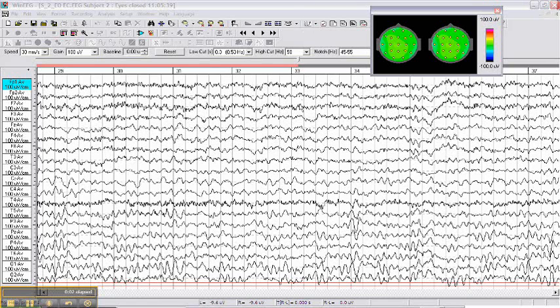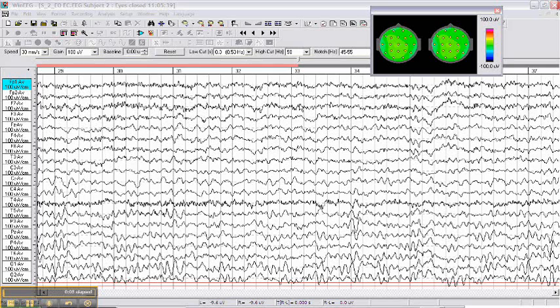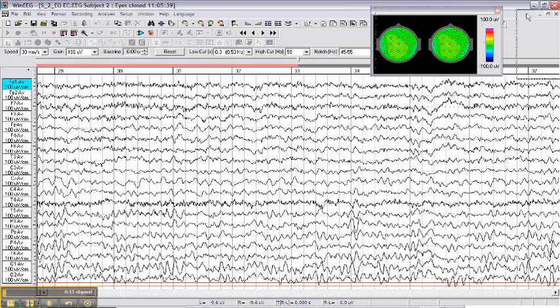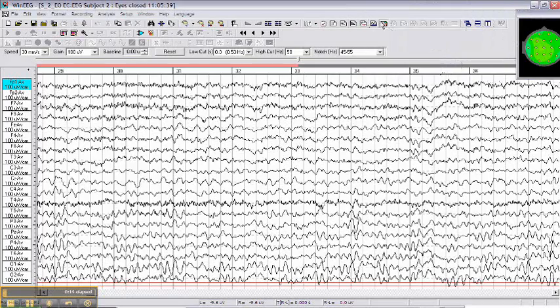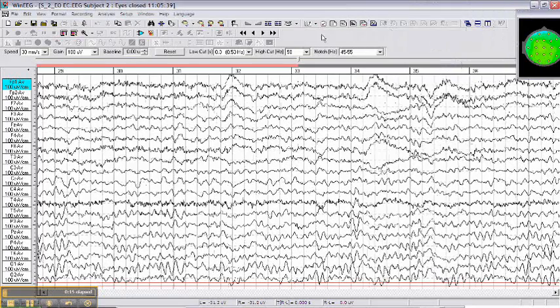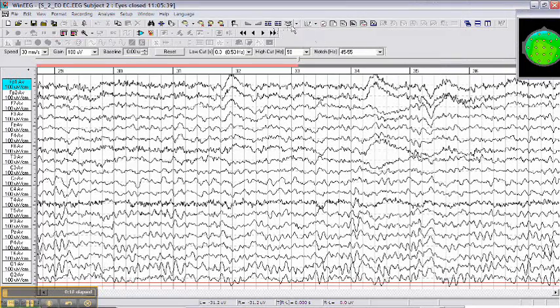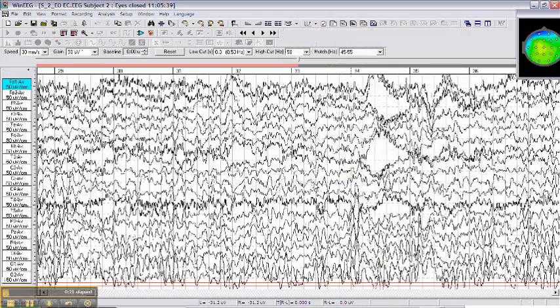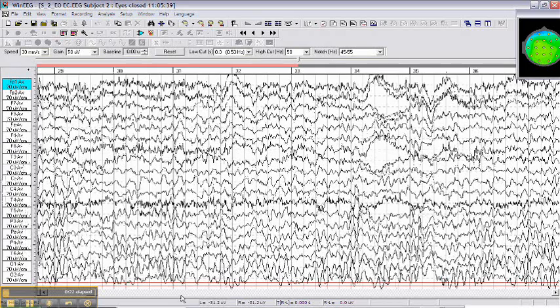Now we're going to show how to perform independent component analysis on a raw EEG file. So we have a raw EEG file in this case. We go to database montage, say common average database montage.